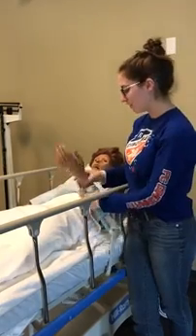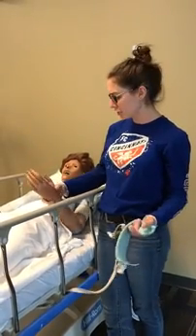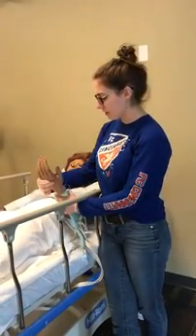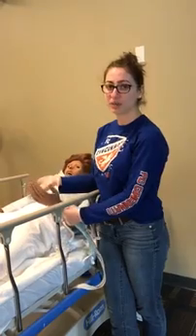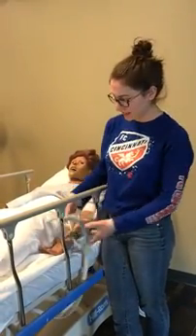So I would look at her wrist, make sure she didn't have any like rashes or redness on her wrists from yanking or pulling, make sure her skin integrity is good, make sure she can move her wrist and do the range of motion, and then I could reapply it if necessary.